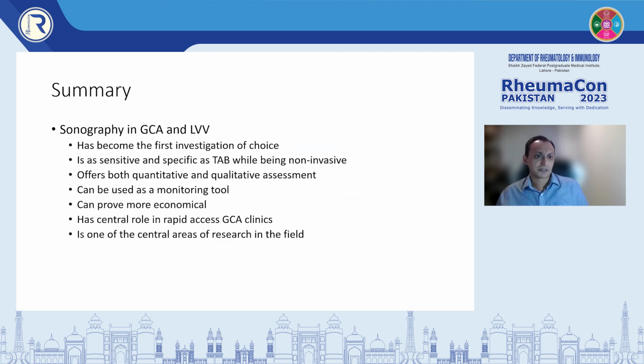So in summary, sonography in large vessel vasculitis and GCA has essentially become the first investigation of choice. It is non-invasive, it is less expensive, and as sensitive and specific as temporal artery biopsy, if not more than that.